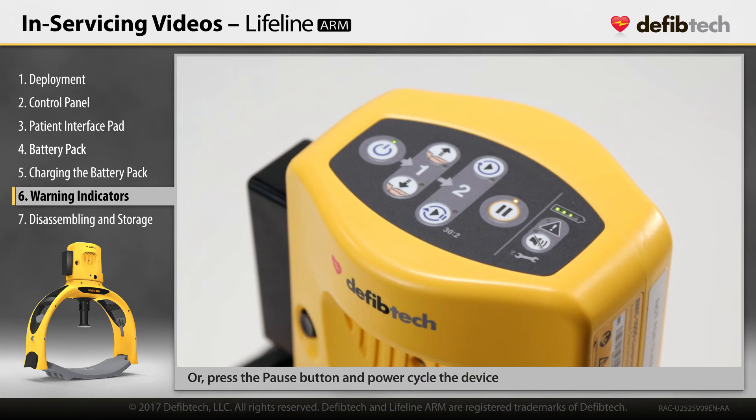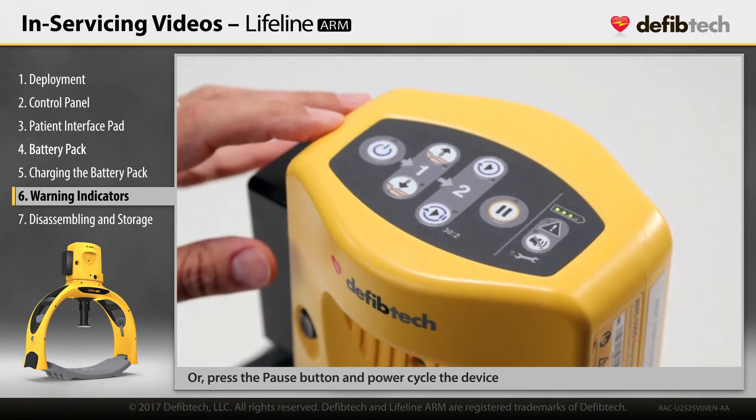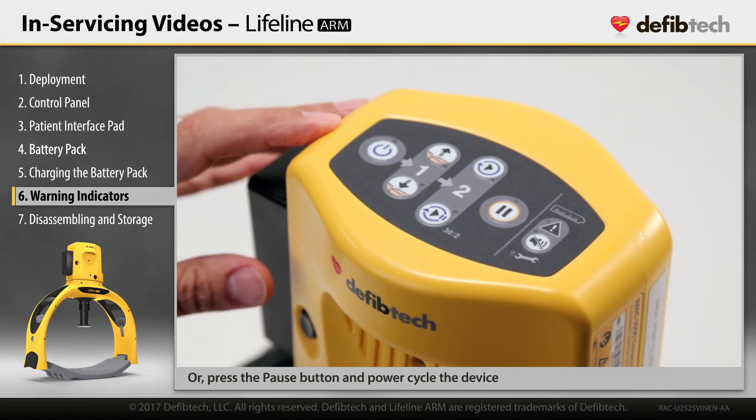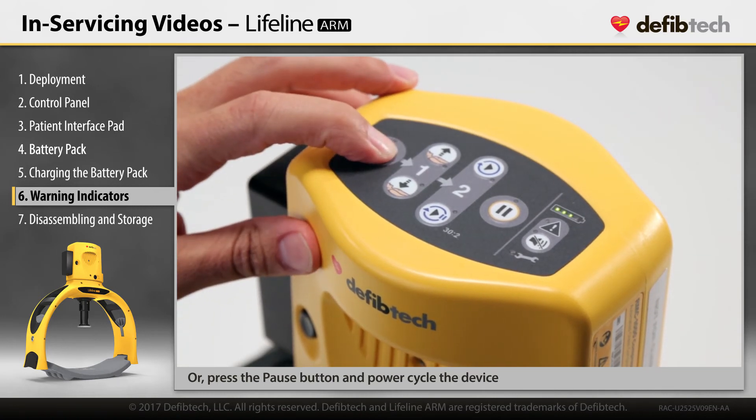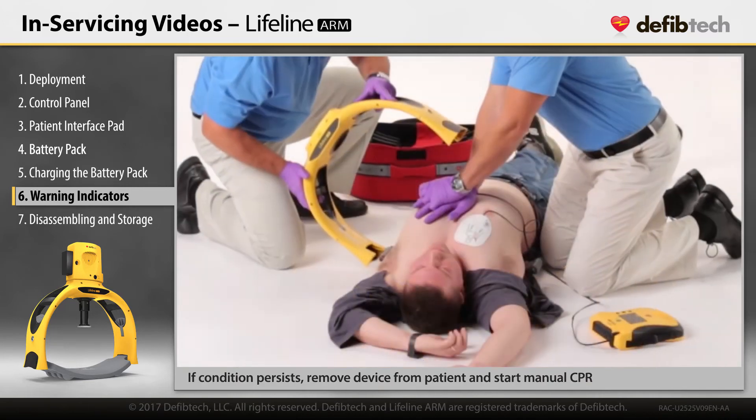If the device fails to perform compressions, push the on-off button for one second to power off, then push the on-off button again for one second to turn it back on. If the condition persists, remove the device from the patient and start manual CPR.